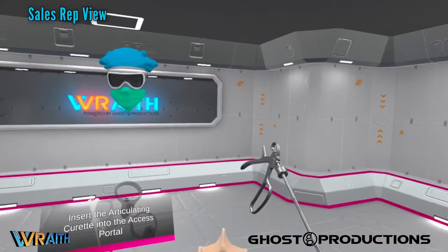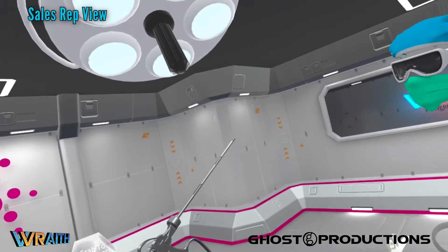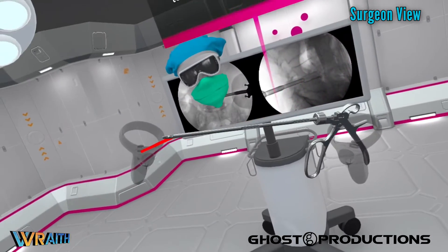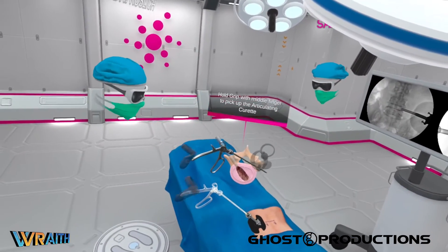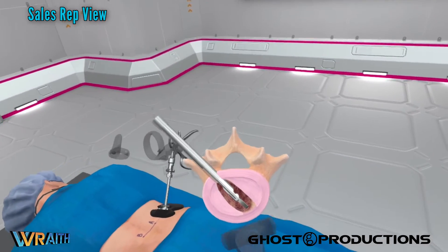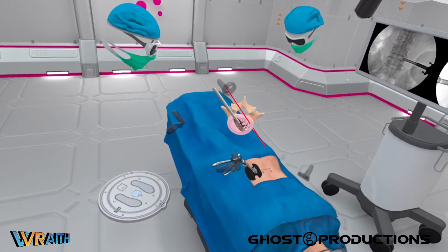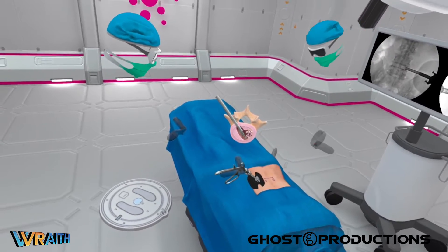This is the articulating curette. You actuate it with this full trigger, and when you pull the trigger, there's a cutter on the distal end of the tool. We use this to debulk the nucleus material. Once it's put into the access portal, you'll see it — get a better view of the end of the articulating curette. It does basically what it says. You can see how that's debulking disc material.